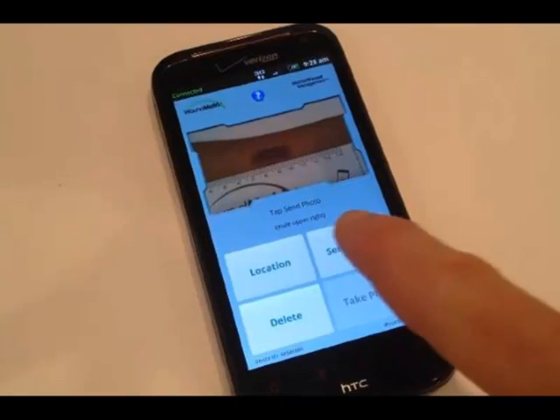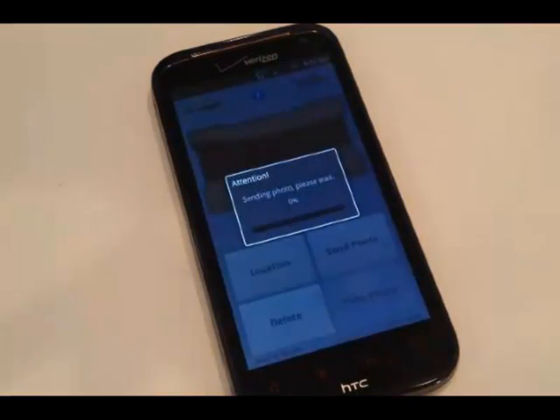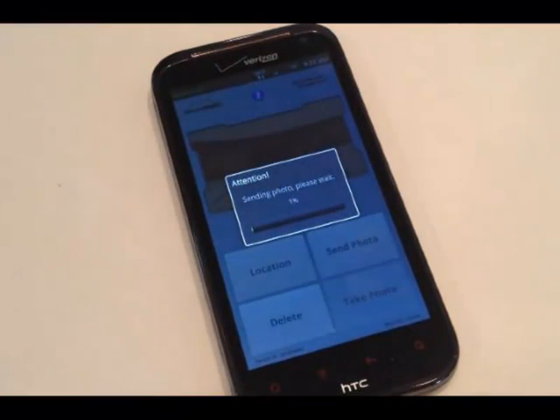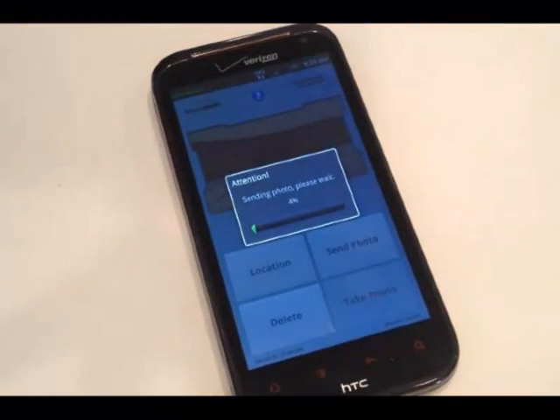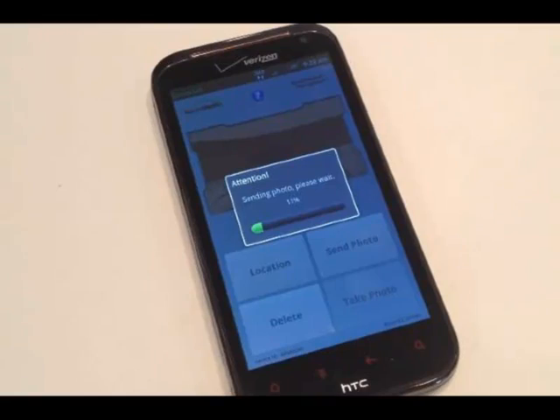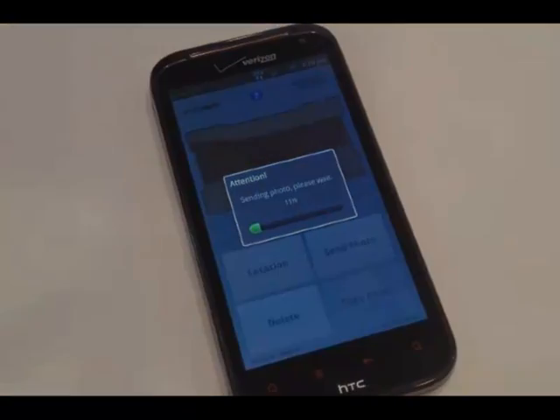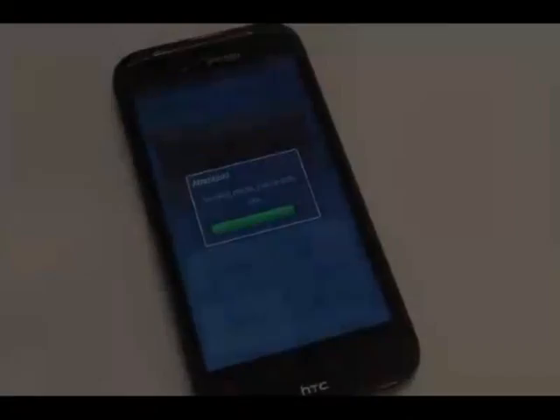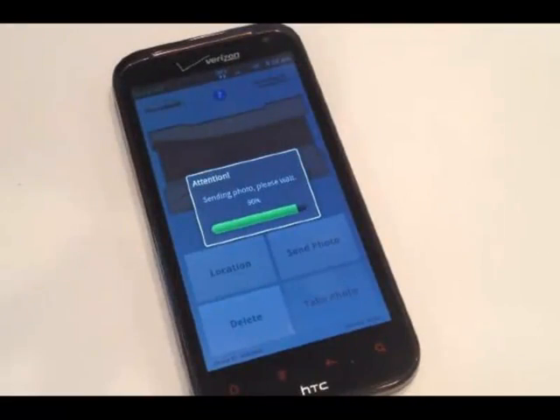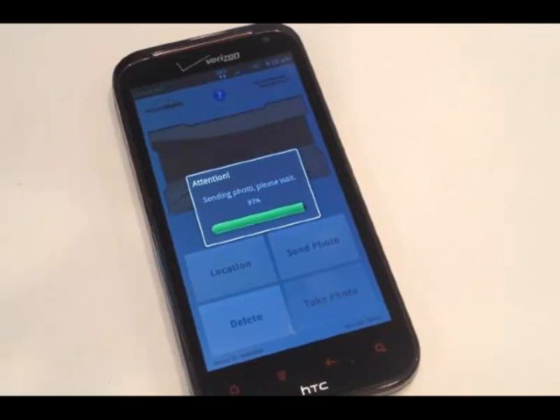To upload your photo, simply tap the send button. A message with a status bar appears indicating your photo is being uploaded. When the upload is complete, you will return to the main screen and a message will confirm your photo has been sent to your provider.